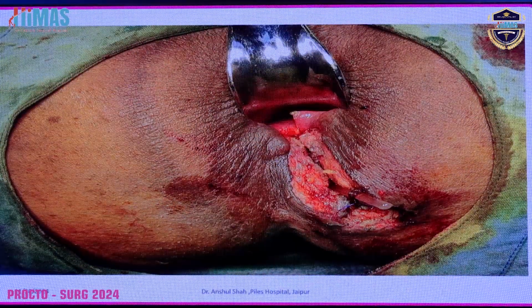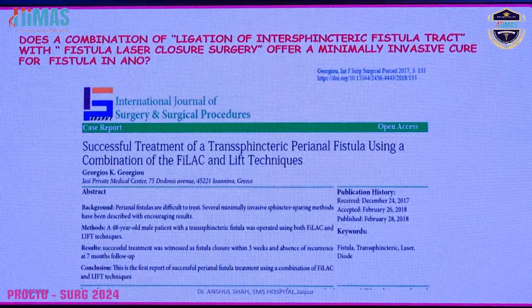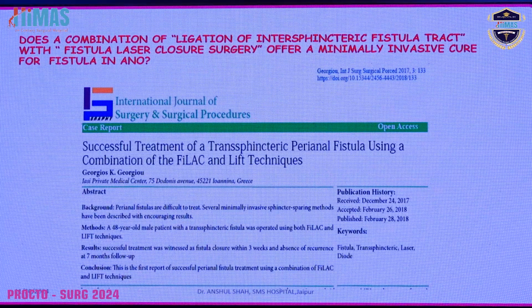So this is how it comes out to be, and this is the final image of the patient with this drain inside. As you also heard from Dr. Kalyankar sir, we can also use Filac with this Vaaft.